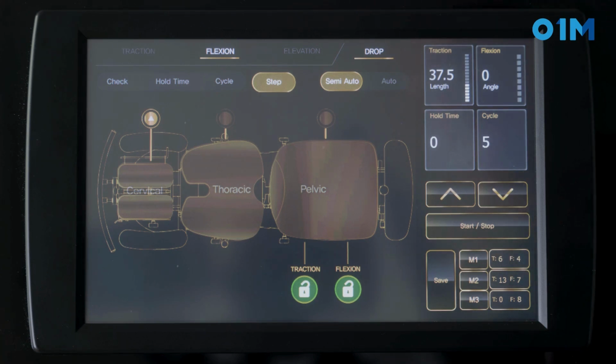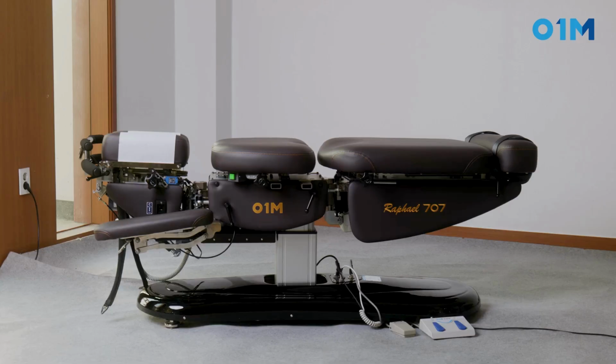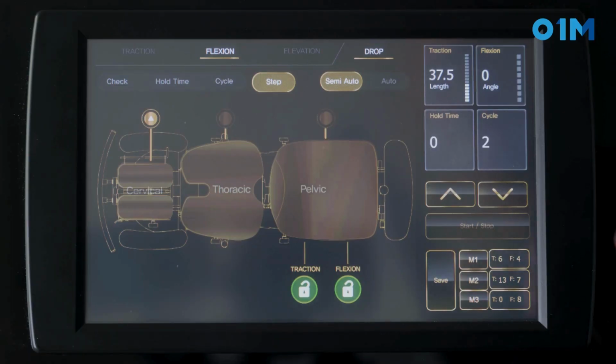And that's what that function does. So let's take a look. Just put it, come back, a little bit more, come back, a little bit more, and come back, and so on to reach the value 37.5.